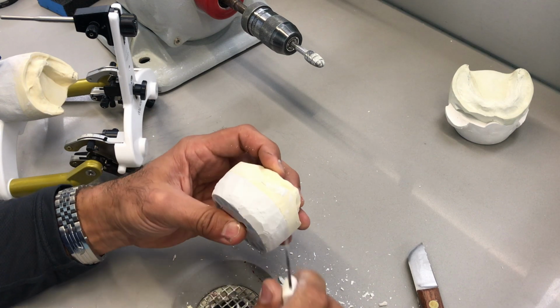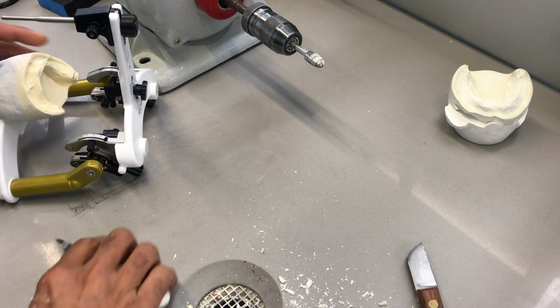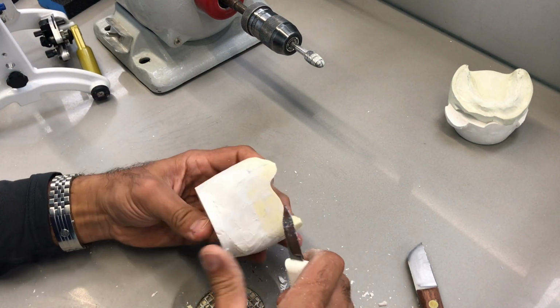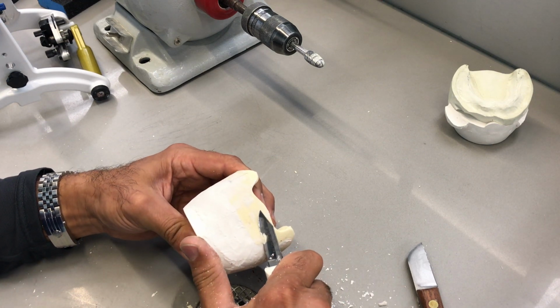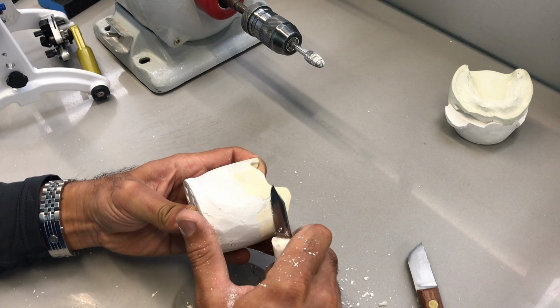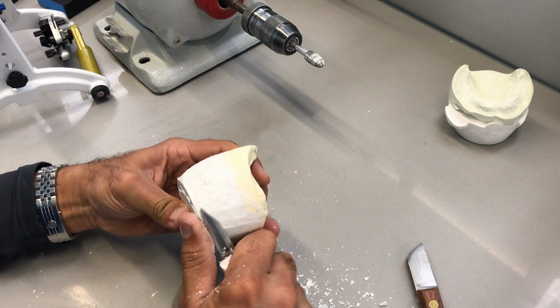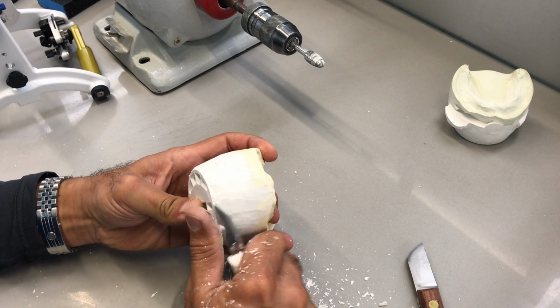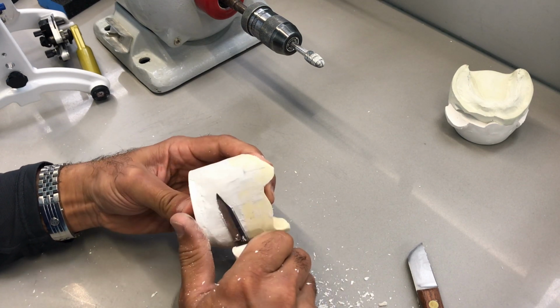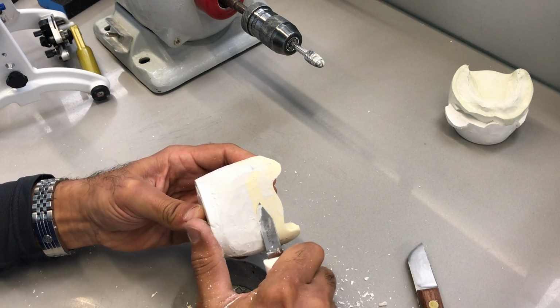That looks pretty good. I'll leave that on the side and continue with the lower. Just take a look where possibly you have a little bit of excess plaster there. You can carve it back, scrape it back, especially around the keyways. You really want to expose the keyways as much as you can. There we go. The back of the model there.